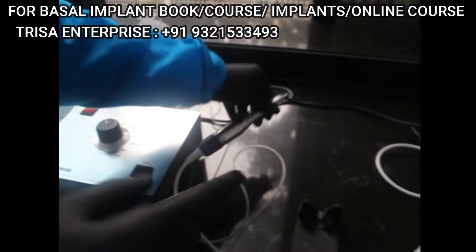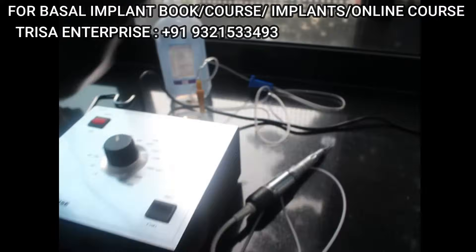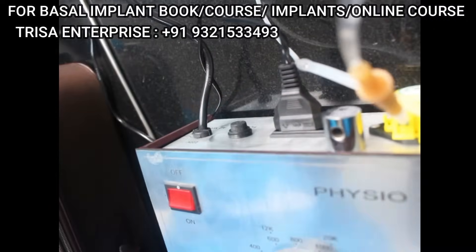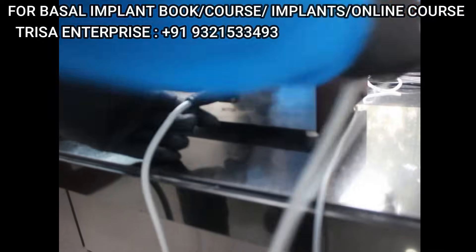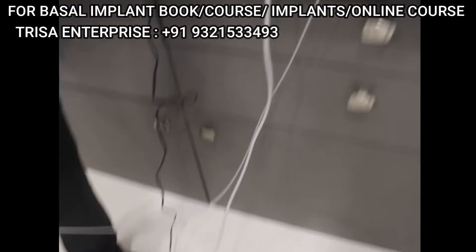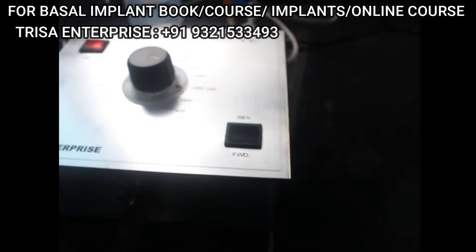Connect the power supply, then connect the power button. Connect the foot control here. Once connected, you are ready to go. Switch it on and you can see the red light has come on. There is a forward mode and a reverse mode — keep it in forward.